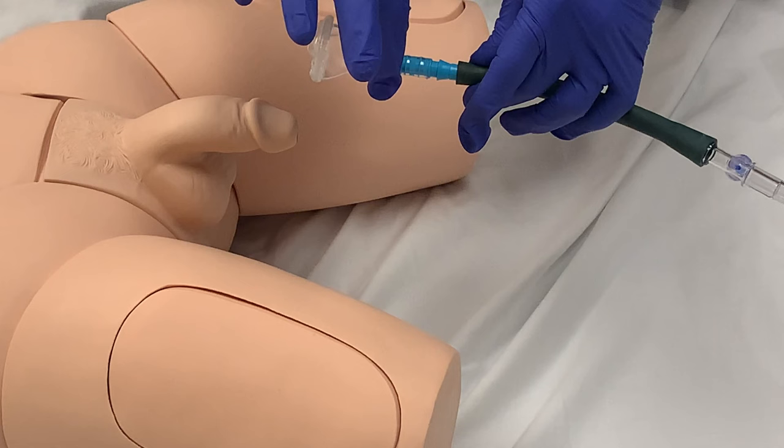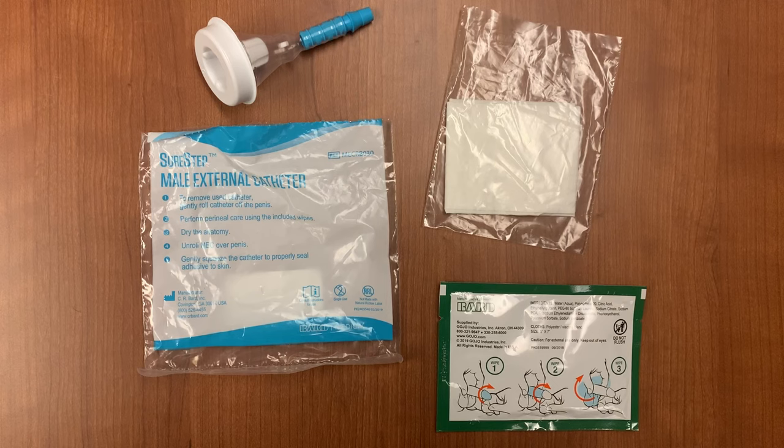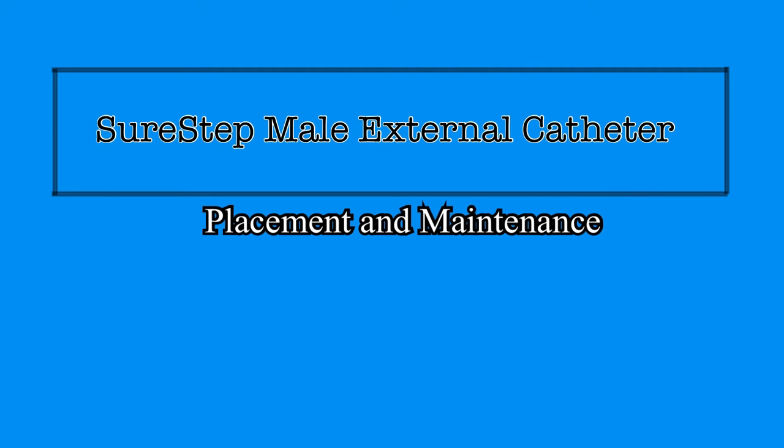Using the same method of cleaning, drying, and application as was initially used, all of the replacement catheters are packaged with the wipes, towel, and condom to make this possible. The SureStep Male External Catheter is an effective method of managing urine in male patients that experience incontinence or have difficulty using other means of toileting. It is a marked improvement over products that have been utilized in the past, and is also less invasive and poses significantly less risk of developing infections than the use of indwelling Foley catheters. At St. Mary Mercy, an external catheter is a nursing intervention and does not require a physician order for use.